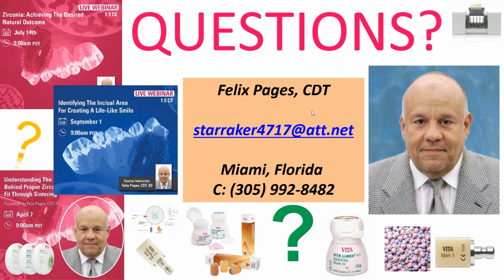It looks like a swirl, and that is made to do the texture on the green zirconia. Now, McLaren is the pro at putting surface texture on zirconia. It just takes him a long time, and the lab guy said, well, we ain't going to do that because it takes too long. But he does a good job with that.